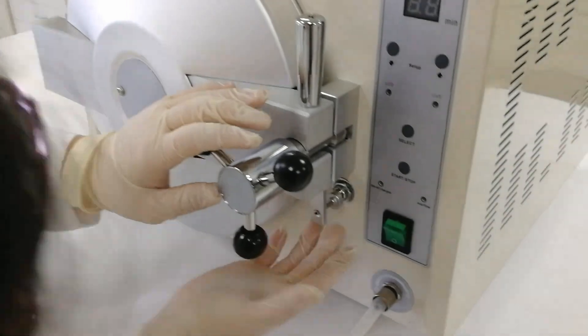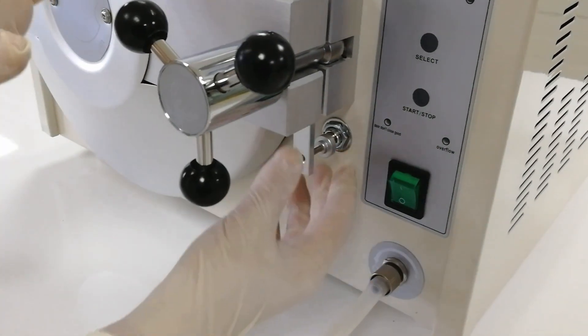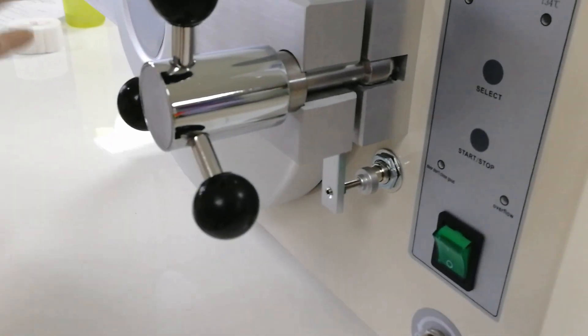Here we hear the sound of the bay as this part attaches together, then we stop. It means it's closed well.